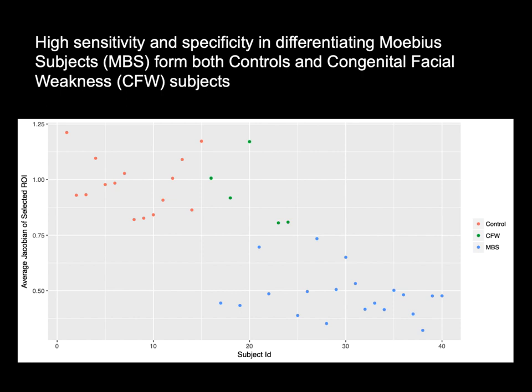The data that is shown here is that you take a template for the population, and then you register each subject to that template. And so then the question becomes, how bigger or smaller is the structure locally at each location with respect to the reference? Okay, so let's say you have a population of controls, and then you could register other controls to that population of controls, and then you register your patients to the population of controls, and then you plot the data.